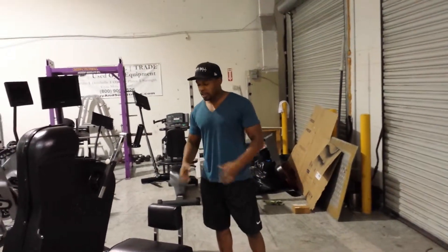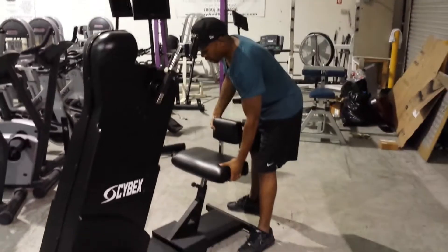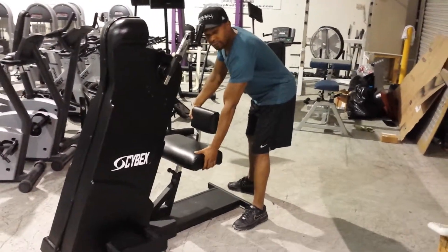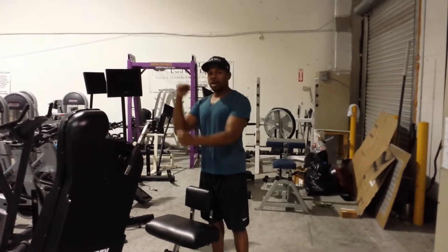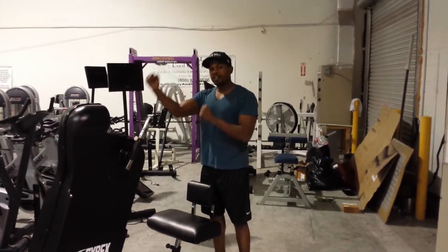How it works is patients who are able to do cardiovascular body workouts can sit down here and pedal just forward and backwards. They're able to do the rotation for their arm, rotator cuff, or any part of the upper body extremities.